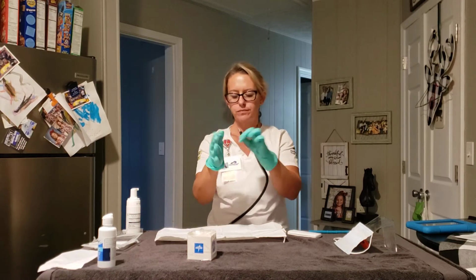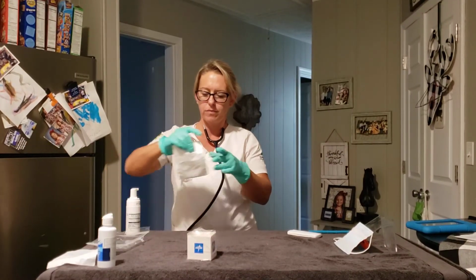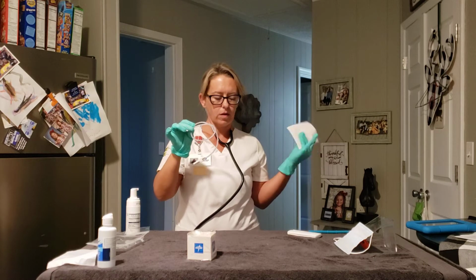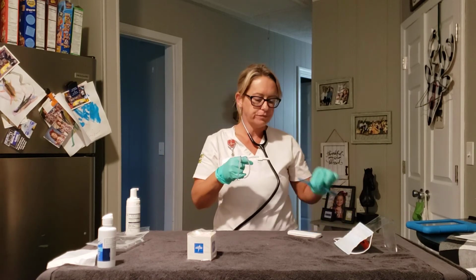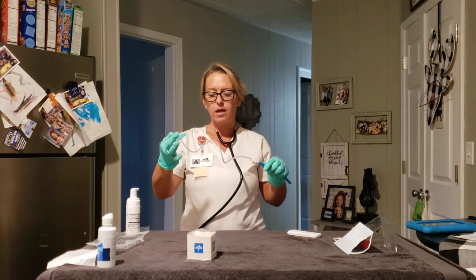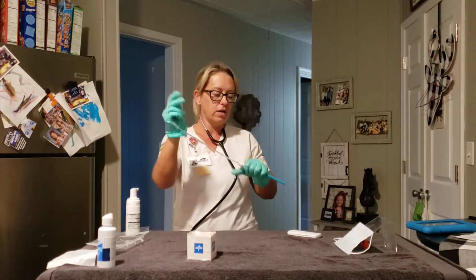Okay, I'm going to go ahead and hook up the tubing. Okay, I'm going to go ahead and test that the suction is where I need it. So I'm just going to, without touching the center or the sides or the bottom, the plastic inside where it's sterile. Okay, it's suctioning good.